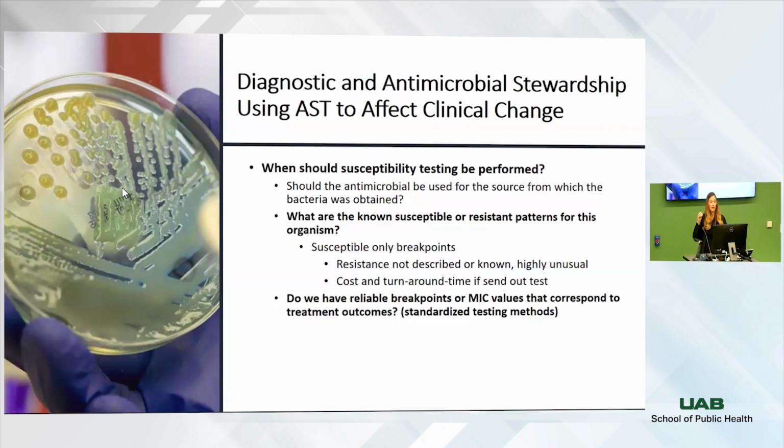And then we say, what are the known susceptibility or resistant patterns for this organism? Does this only have susceptible breakpoints? Is resistance even described for this organism? And then what's the cost or turnaround of a send out test? It does you no good to get results back on an infection if you're going to be done with treatment by the time you get it back, right?